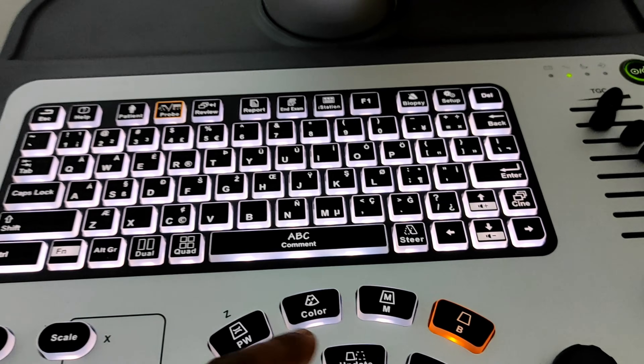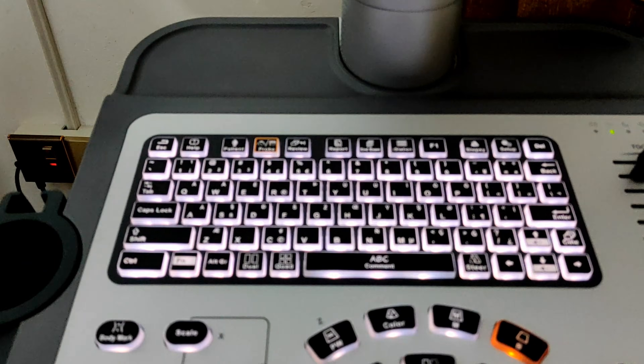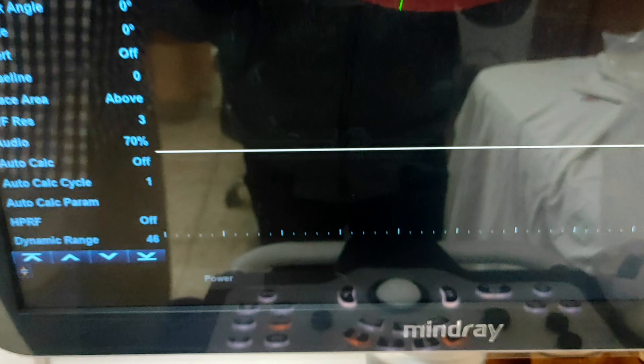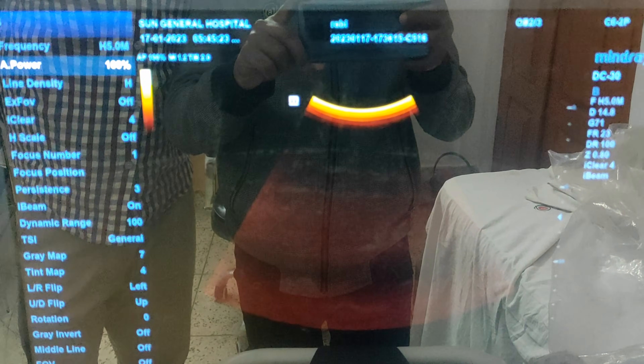To listen to the fetal heart sound, first go to single mode or B-mode and press the PW button. When you press the PW button, a targeting icon will appear — move it with the mouse to where the fetal heart is placed. Now press the update button. A waveform line will appear indicating the heart sound of your fetus. You will also hear the sound from the fetal heart, and the wave indicates the fetal heart rate.